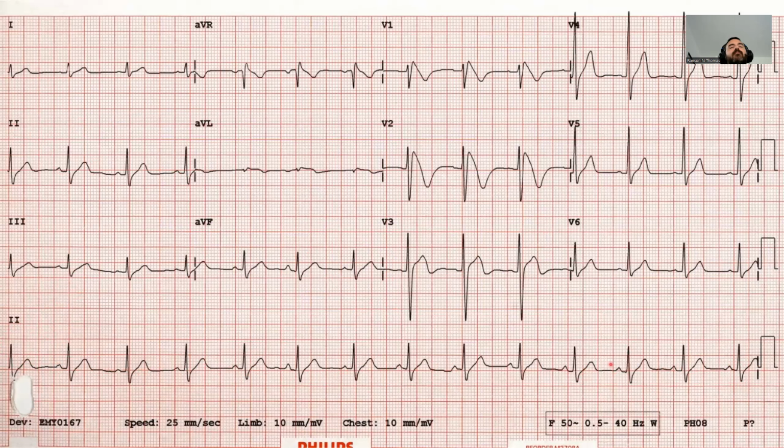Not always, but typically. If you are getting a telemetry box, because a lot of people on cardiac monitoring are not getting 12 lead EKGs continuously, especially on a med surg floor. They'll be on tele, which means there are fewer leads. And usually the tele box with the patient might have a screen where you can display the lead on the box itself. If not, it'll be up on a monitor in the nurse's station where you can look at it. And even if there is a little screen on the box, you'll always be able to see it in the nurse's station.